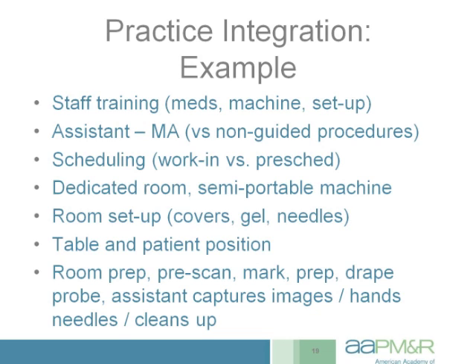In my practice, I just pretty much have one MA working with me when I'm in clinic, and she's been very well trained in the ultrasound machine. She knows what I need for each procedure, and if we're going to be adding a new procedure to the practice, I make sure I do some upfront training so she understands what probe we might need for that procedure, what needles, etc., so we stay time efficient.